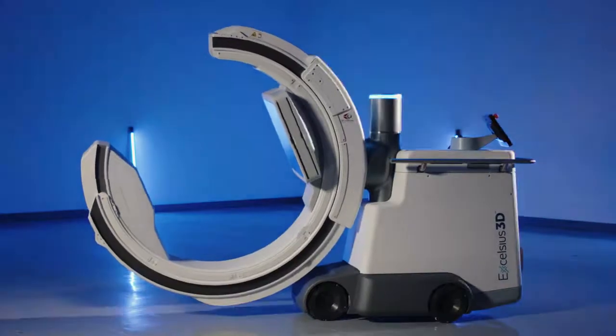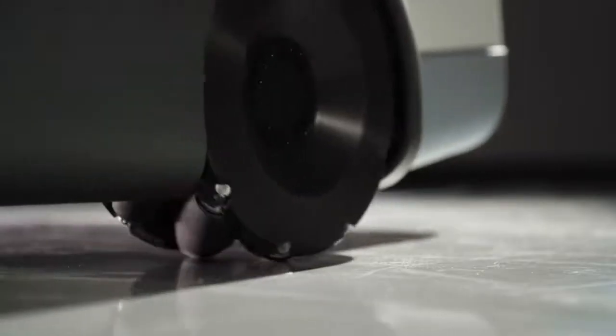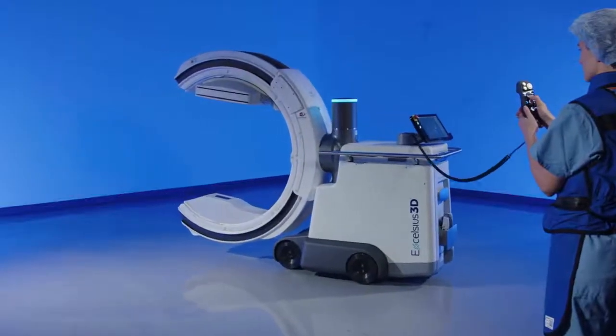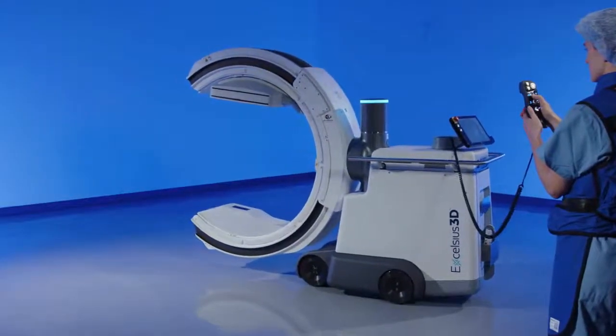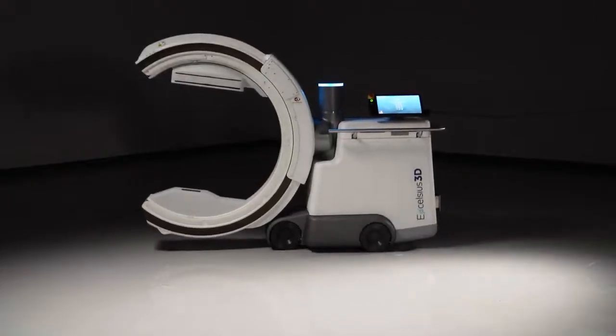The base sits atop four power-driven omnidirectional wheels, or omniwheels, that streamline imaging setup due to their ease of motion. The omniwheels glide seamlessly across the floor in any direction for intuitive and fast transport.